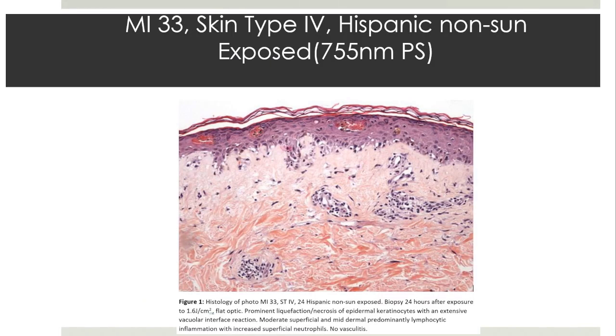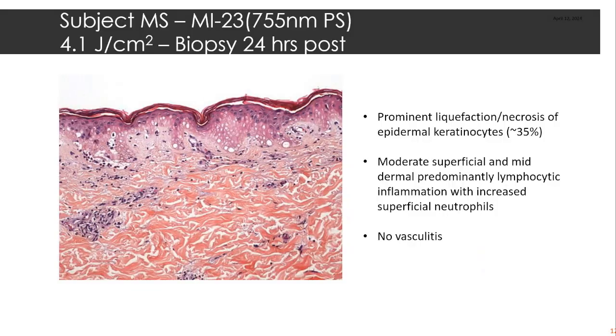When you take a little bit more energy in a darker skin type, you start to see bigger steam bubbles, and this is where you start to get into the issue of PIH. At higher energy yet, more in the way of epidermal damage. This will definitely create PIH and maybe a blister.